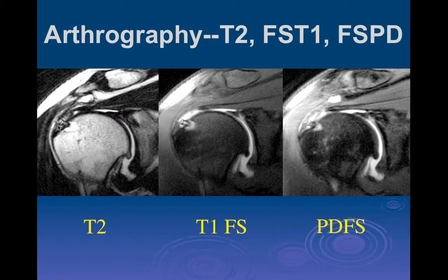From our standpoint, as we're reviewing it, as long as the tendon is still partially intact, that's really what's most important after surgery. The most important thing is function. It's not what it looks like. All you can do is describe what you see, and then let the people decide on the clinical side what to do with it.